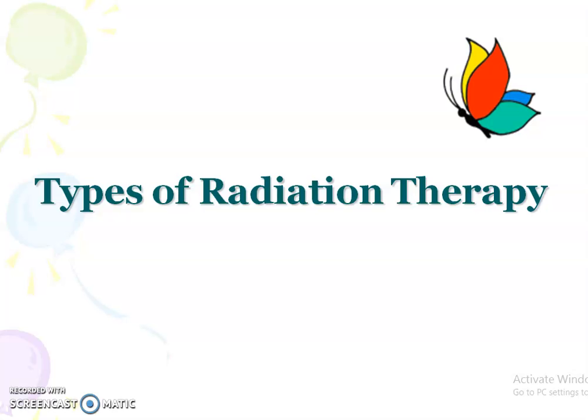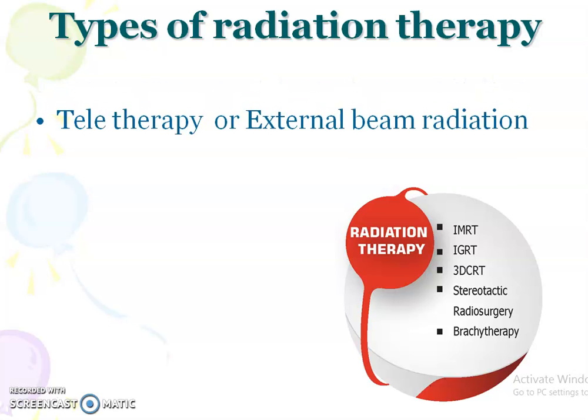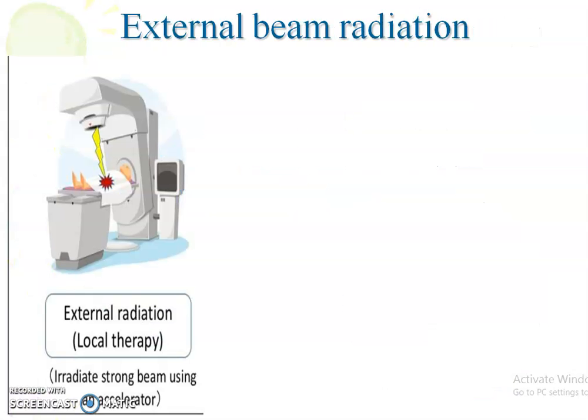Let us discuss the types of radiation therapy. Radiation therapy is mainly of three types: teletherapy or external beam radiation, brachytherapy or internal radiation, and radiopharmaceuticals. So let us discuss in detail teletherapy or external beam radiation and its types.